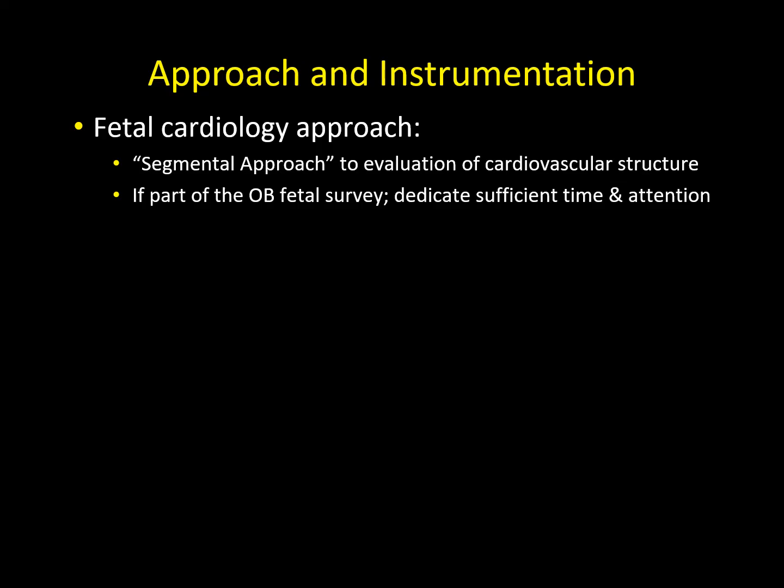Your approach to fetal echo should be a fetal cardiology-centric approach, which means typically we use a segmental approach to look at cardiovascular structure. We put the heart together as puzzle pieces, segments from the atria to the ventricles and the ventricles to the outflow tracts and the arteries. That's our segmental approach to looking at fetal cardiovascular structure. And if you add this in as part of your OB's fetal survey, you want to make sure that you dedicate plenty of time and attention to the heart, the cardiovascular structure, so that you don't miss anything.